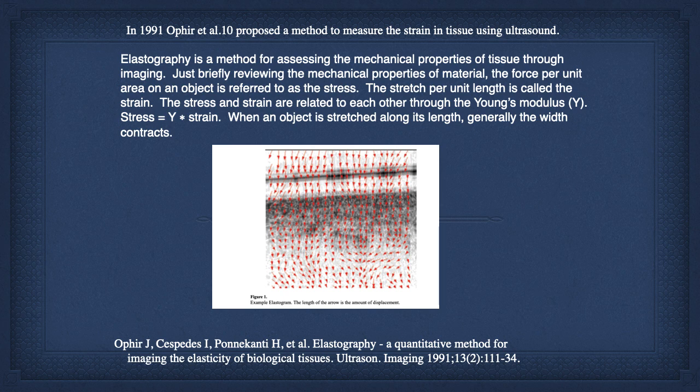As far as I know, these are the fathers, or the originators, I don't know if they're men or women, of elastography. And so, elastography, like PS-OCT, is just a powerful technology. It tells you the composite. It tells you the tensile strength of the tissues. To be more specific, the elastic modulus, and we've studied this a lot up until 2010.